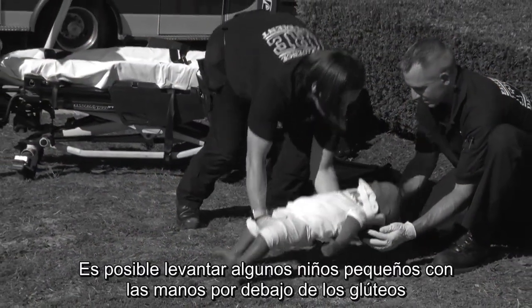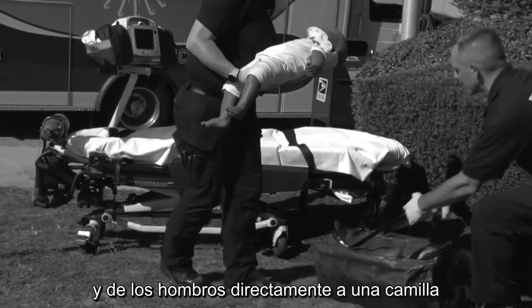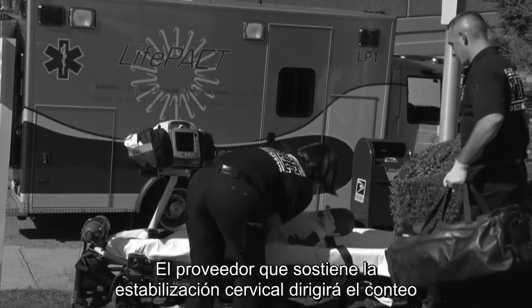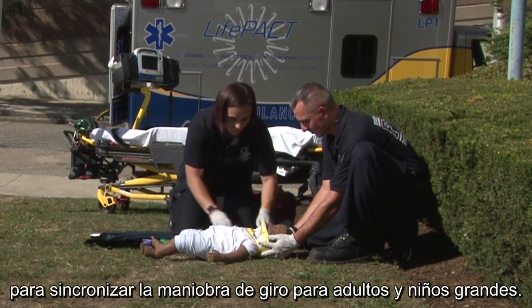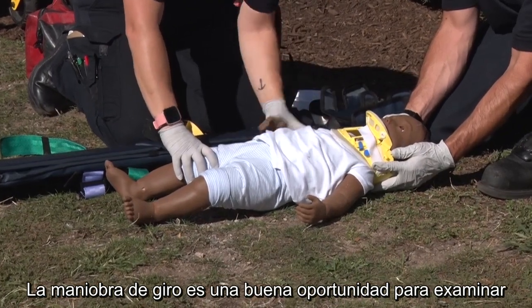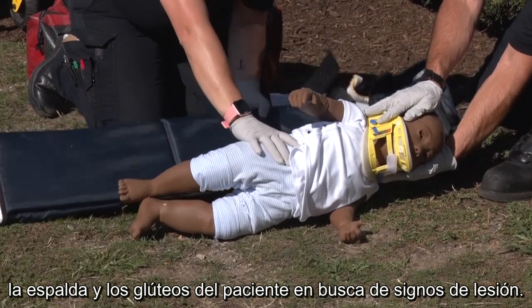Some small children can be lifted up with hands under the buttocks and shoulders directly to a stretcher, or to allow the stabilization device to slide underneath. The provider holding cervical stabilization will lead the count to synchronize the log roll for adults and large children. The log roll is a good opportunity to examine the patient's back and buttocks for signs of injury.